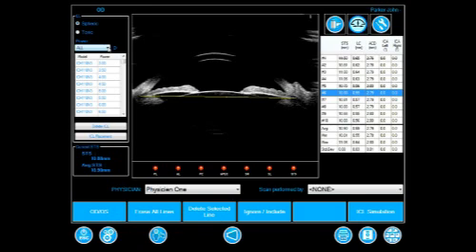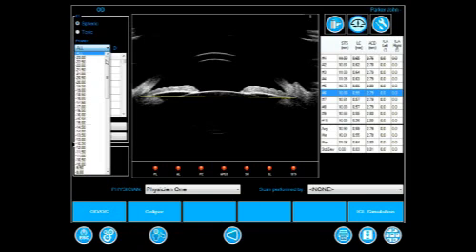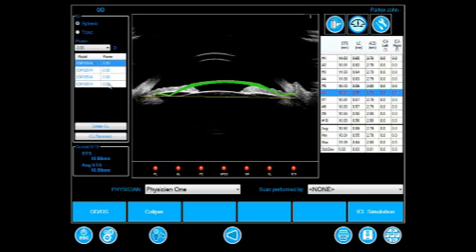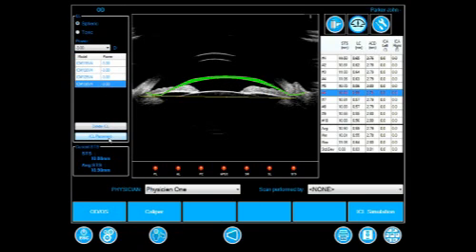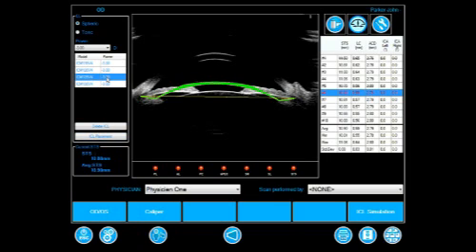He selects the power. He clicks on the ICL placement button in order to position the implant automatically before running through the various implant options.